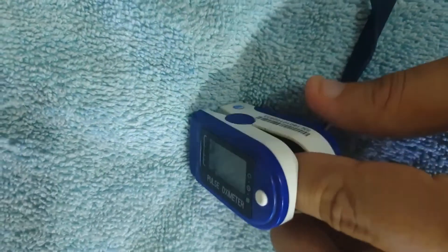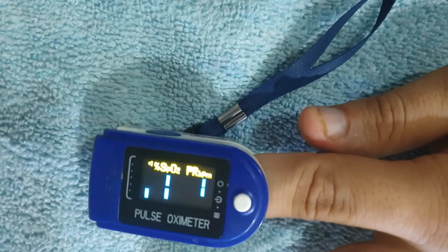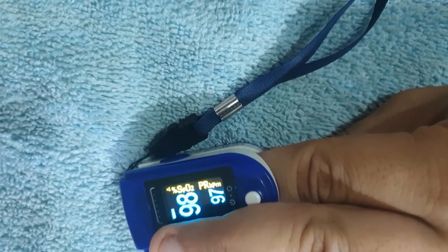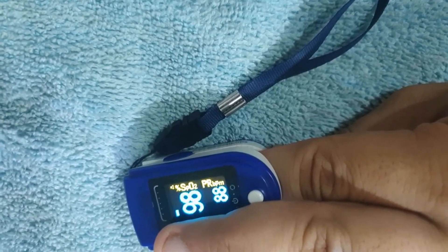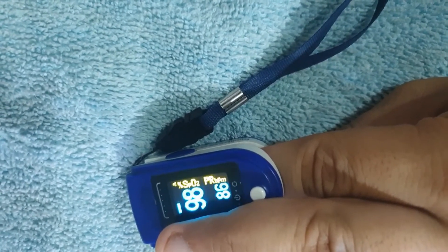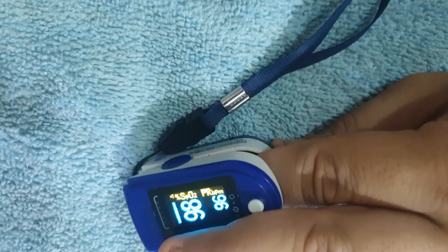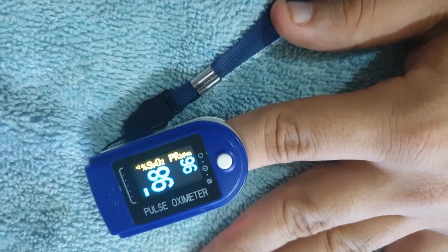You can use the device on any finger — it is rather immaterial — however, if possible, try to use the middle finger because it has a double blood supply, so you will get a slightly better reading. Also try to keep the device on for at least 40 to 50 seconds to get a perfect reading. If you keep it on for only a brief time, the readings may be inaccurate. It takes around one minute to stabilize.